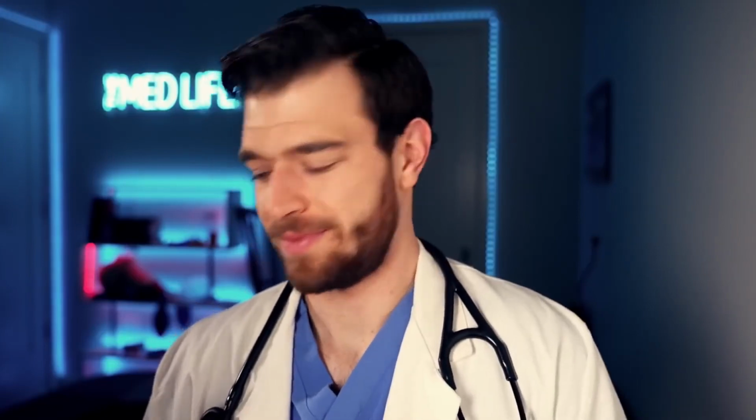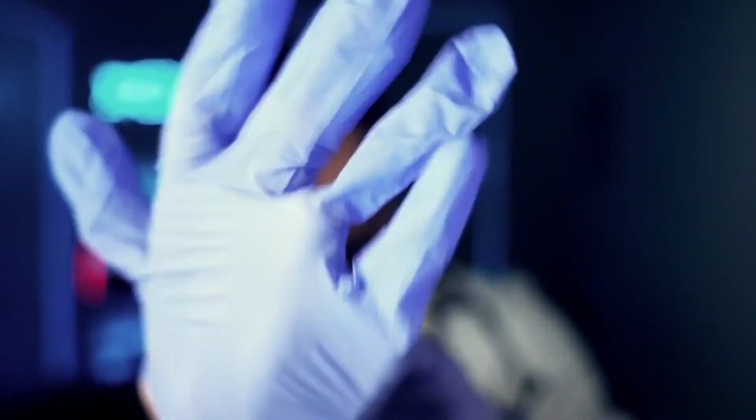Okay. Now, first thing, as always, I would just like to do some vitals. Sometimes things like high blood pressure can affect your vision, so that's why I'd like to check that today. If it's okay with you, I'll put some gloves on, and we'll start out with your heart rate and respiratory rate. Excellent. You just sit back and relax, and I'll go ahead and start monitoring your vitals here. Good. Just going to keep an eye on the clock here, get an accurate count. And if you'd like, you can do some nice slow breathing, whatever you need.